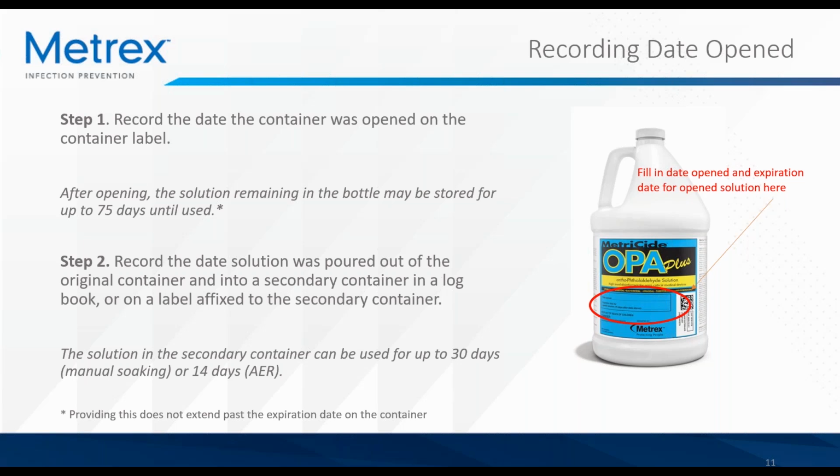If you'll be pouring out the entire contents of the gallon bottle on the date of opening, this step is not necessary, as there will be no solution left in the bottle to monitor for the 75-day expiration.